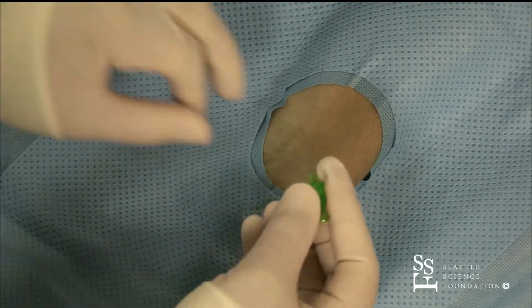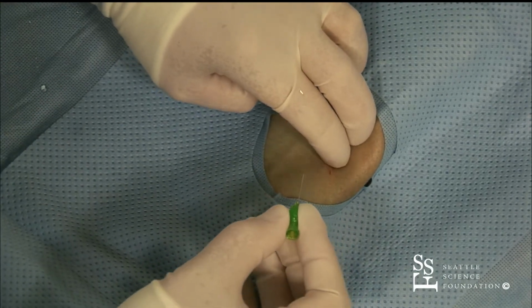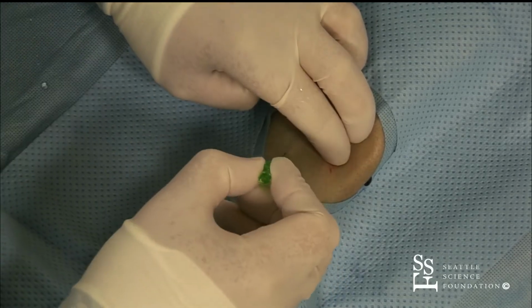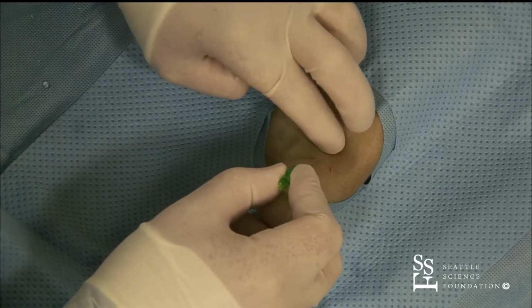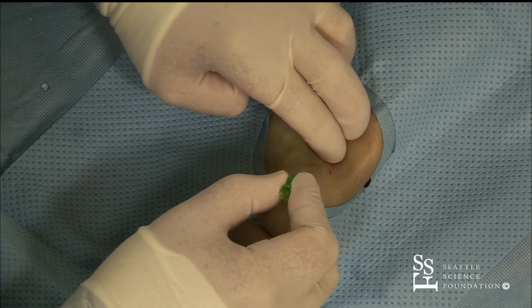Okay, so this is a Cook needle. It's a pediatric Cook access needle, as you see here. Your institution probably has them, if you're not routinely using it. So this is one way of doing it, and this is the most conventional, what you're used to doing with the Seldinger approach from the groin.